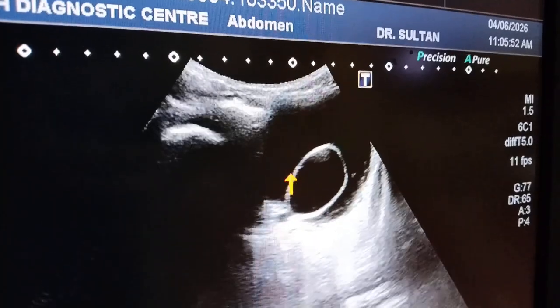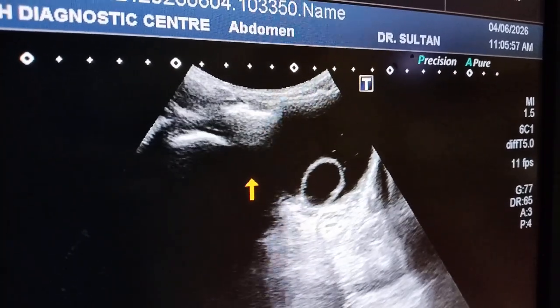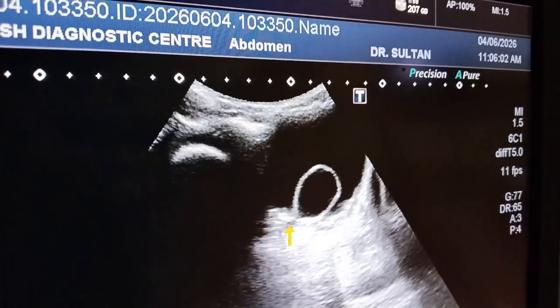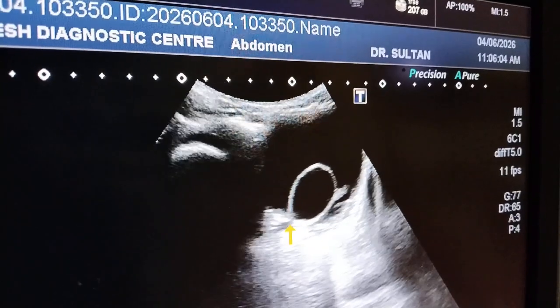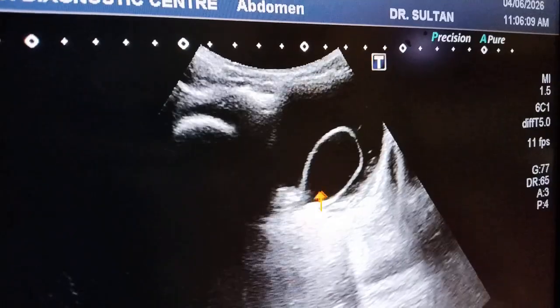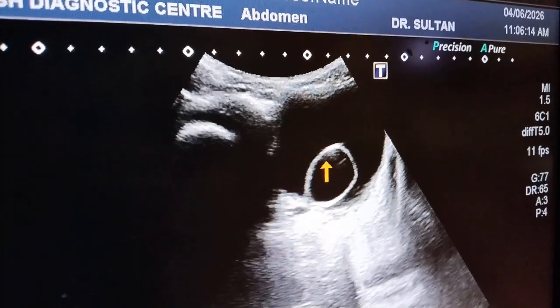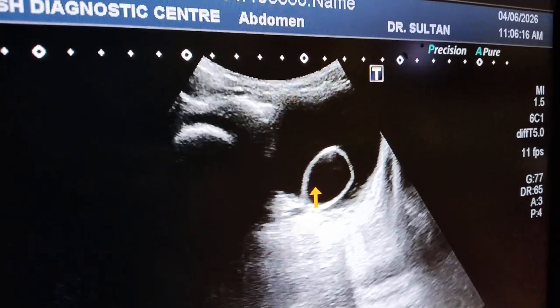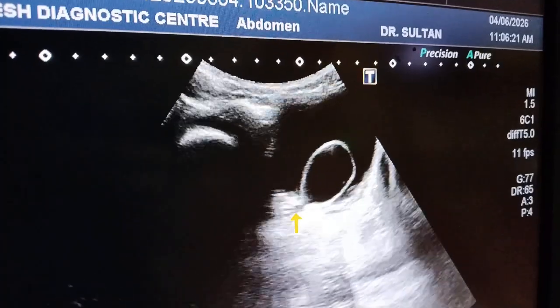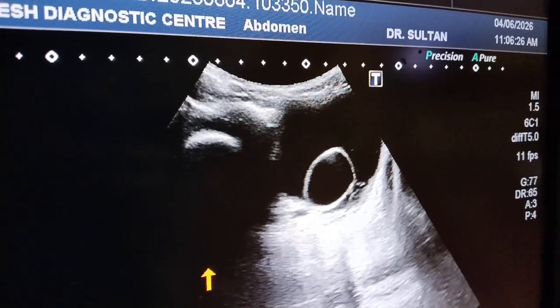This patient is likely having a right-sided ureterocele. There are two types of ureterocele we usually try to describe. One, the intravesical ureterocele, which projects into the lumen of the urinary bladder, and the other is the extravesical, we usually say the ectopic ureterocele.